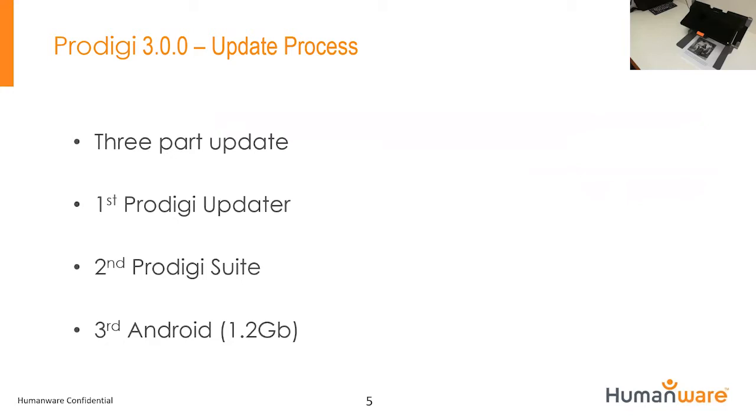And the Android, wait until you have a bit of time on your hands to do. You don't need the Android update to have all the features in Prodigy, but you do need it if you'd like to have the new algorithm.